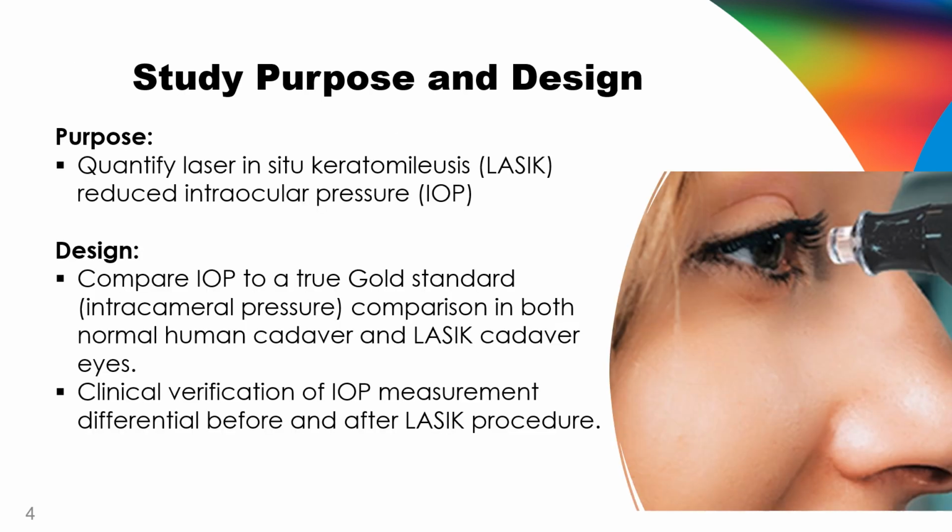So we set out to quantify the IOP drop following myopic LASIK. This method came about in discussions with the FDA about how to qualify IOP measurement improvements over Goldmann following LASIK. Originally, the FDA wanted a direct comparison to intracameral pressure by cannulating the AC before and after the procedure. This was obviously a non-starter. We compromised on intracameral pressure comparison of fresh cadaver eyes, both with and without LASIK. Then the cadaver comparison was validated by clinically examining the difference in IOP before and after myopic LASIK.